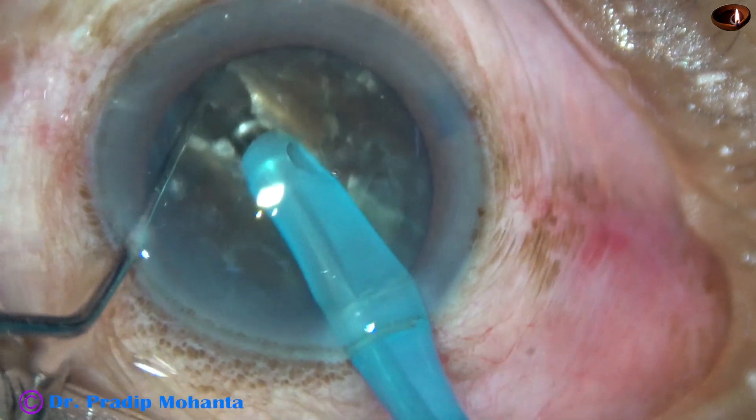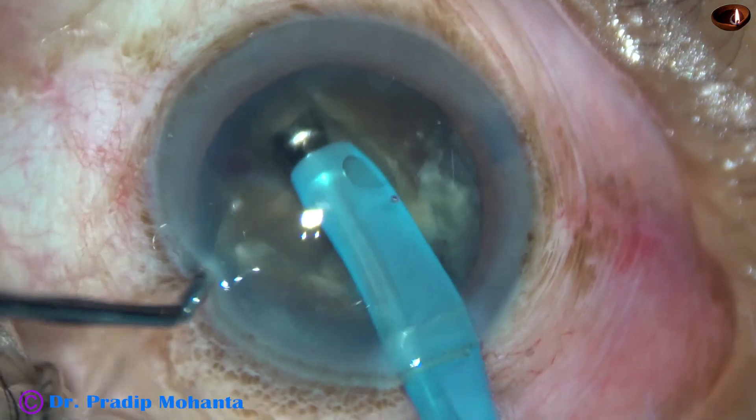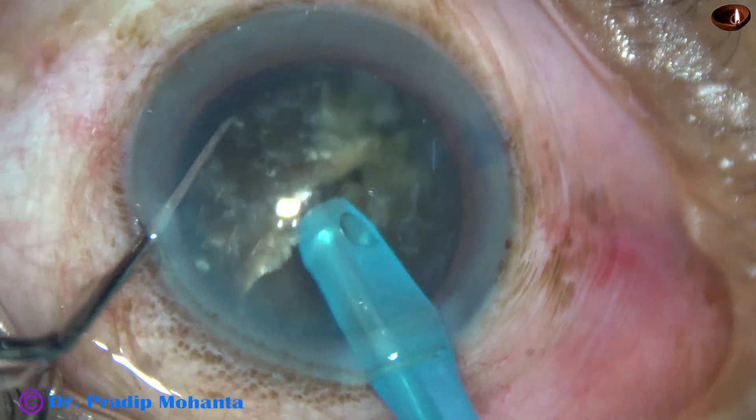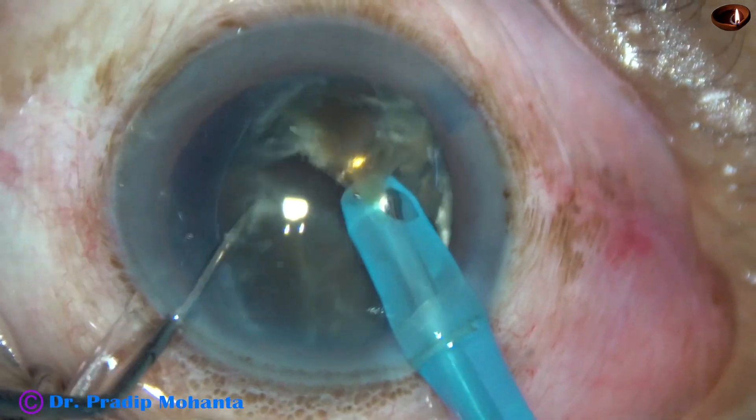180 degree rotation and a few sculpts along the initial crack, and the nucleus is divided completely into two heminuclei. This is the larger heminucleus, which I am going to divide into three pieces.